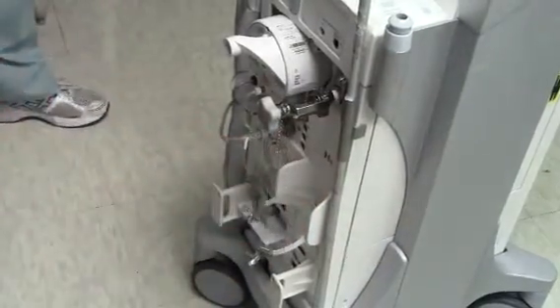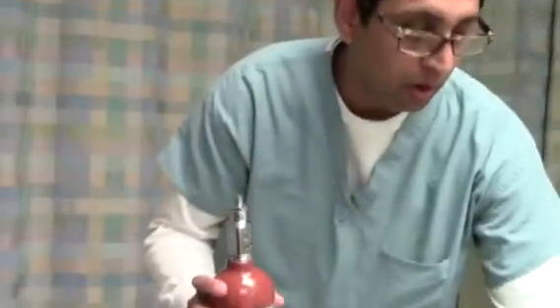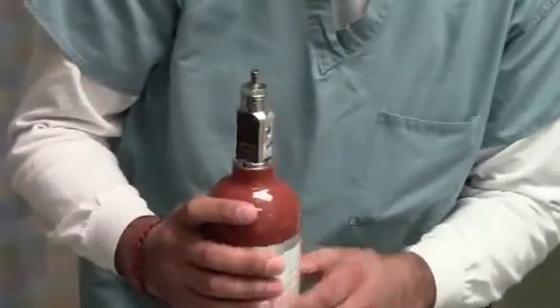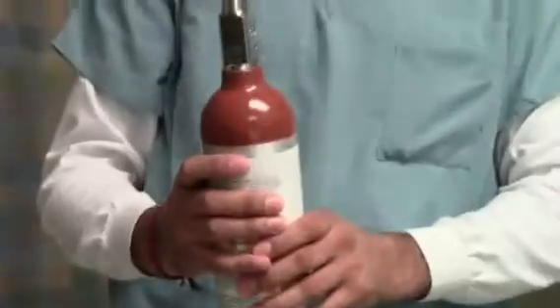Now we're going to get a fresh tank of helium and mount it back on. We want to make sure the female and male ends on the balloon pump match up so it will mount properly.